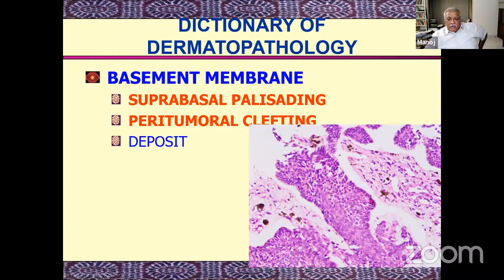This, as you can make out, is almost a normal basal layer in appearance. These are cells which are known as, actually, this is not a normal skin. This is a cancer, which is differentiating towards skin. And you can make out that these cells, the cells in the periphery, have lost their connection with the dermis because, again, as I told you, it's an interaction.